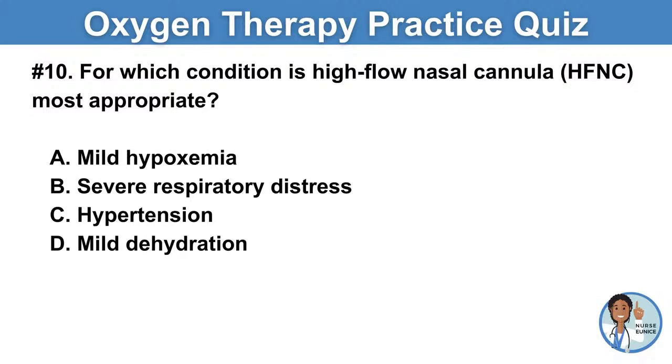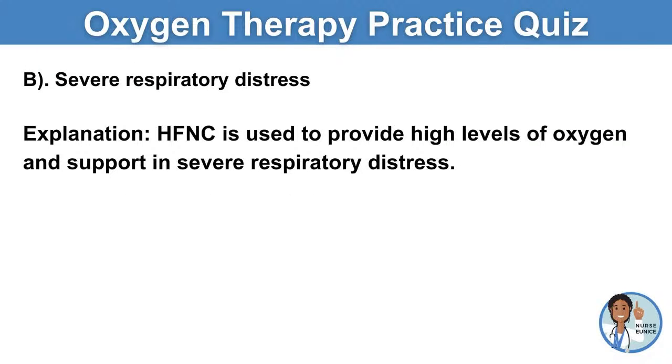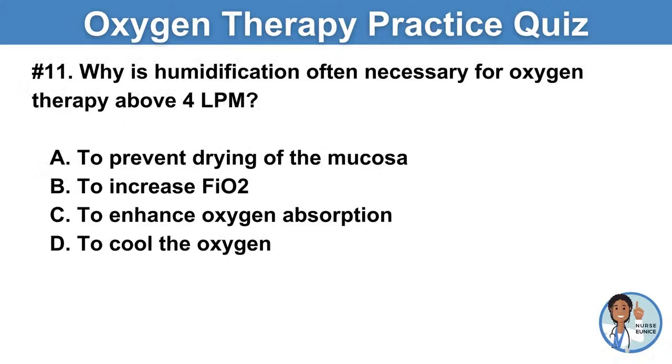So who would need the high flow nasal cannula? Revealing the answer in 3, 2, and yes, everybody. So it's going to be those who have severe respiratory distress.